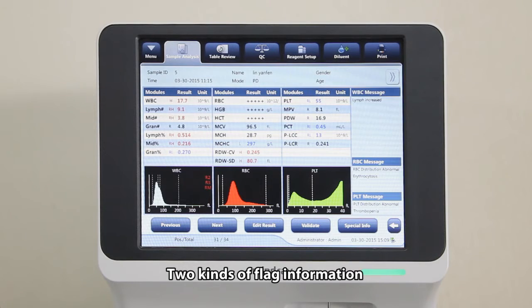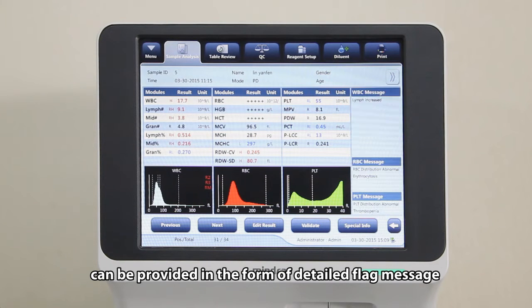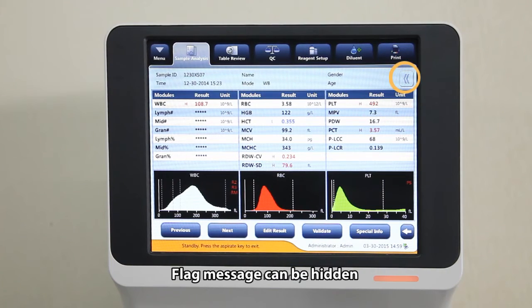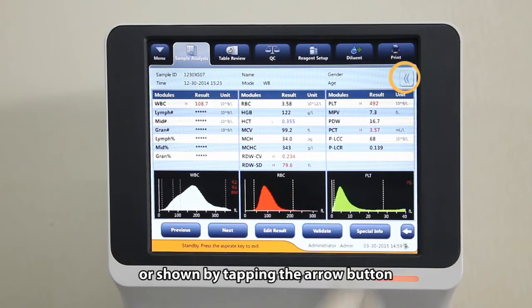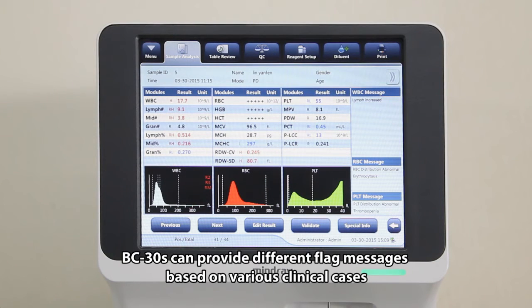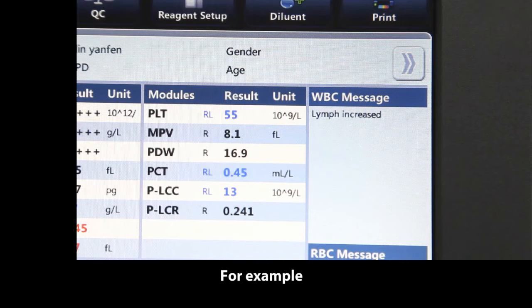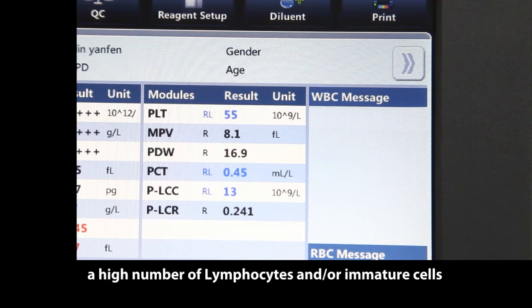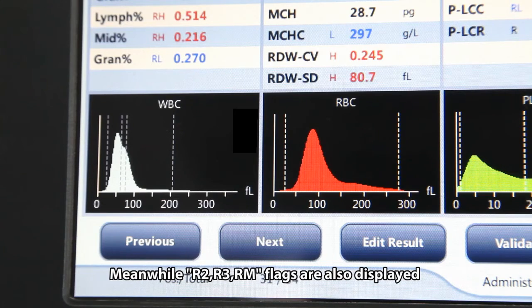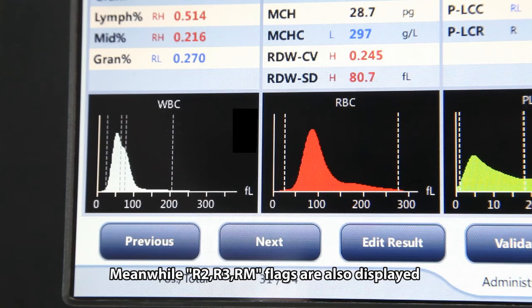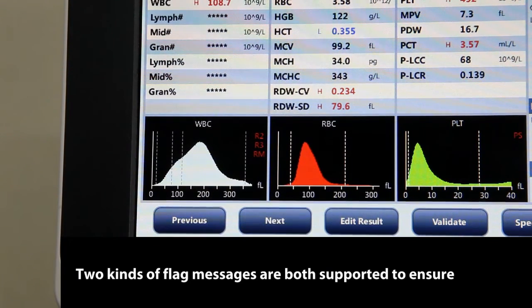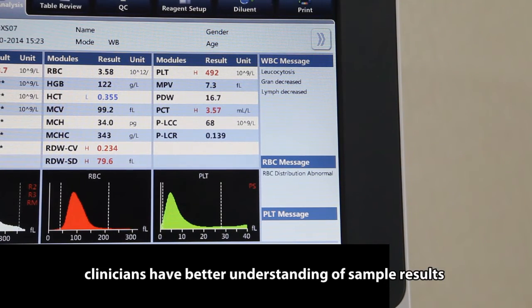Two kinds of flag information can be provided in the form of detailed flag message and traditional markings on histograms. Flag message can be hidden or shown by tapping the arrow button. BC-30S can provide different flag messages based on various clinical cases. For example, lymph increased means a high number of lymphocytes and or immature cells. Meanwhile, R2, R3, RM flags are also displayed. Two kinds of flag messages are both supported to ensure clinicians have better understanding of sample results.